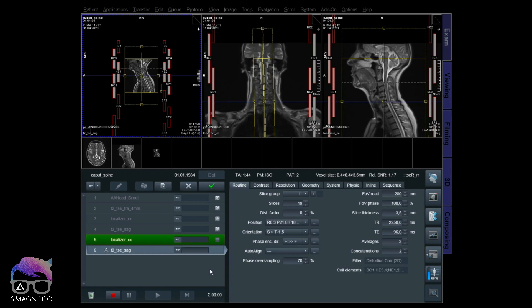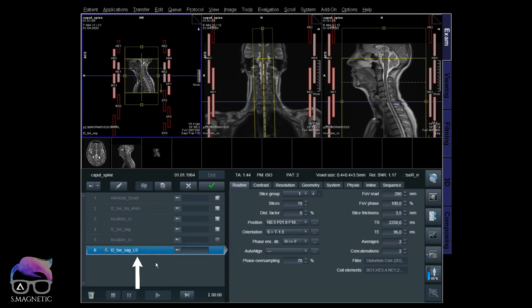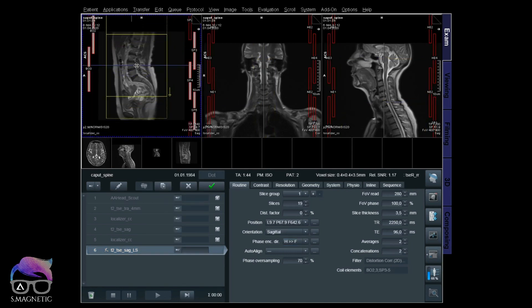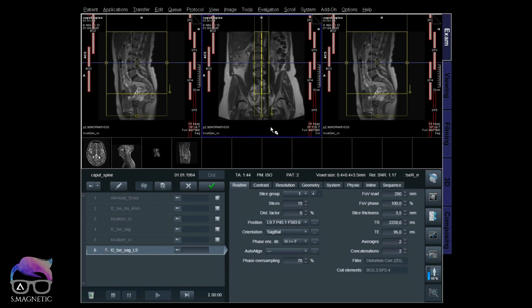I have one last tip for you today which I find very important. I got this tip from my good friend Aspen Anderson, who I mentioned in an earlier video - he shares a lot of MR tips and tricks. I've already pulled down a localizer for the lumbar as number five in the line. Let's run that and I'll rename the T2 for lumbar and position it as a standard lumbar.